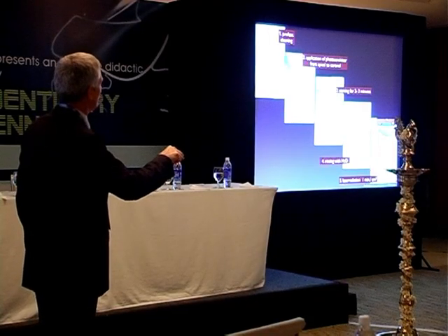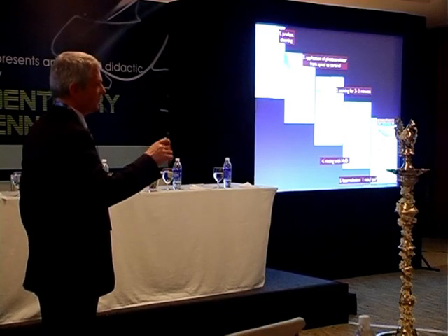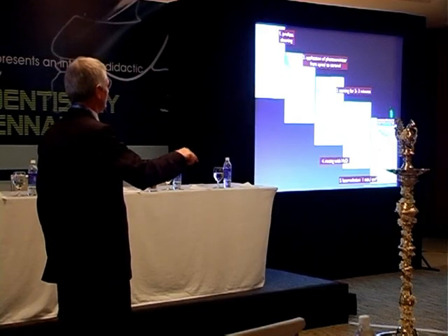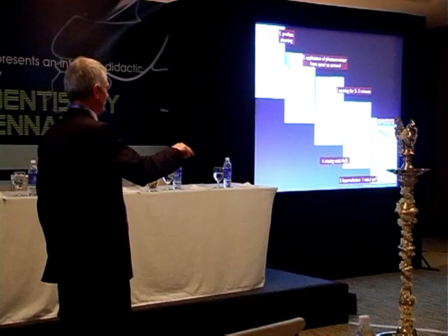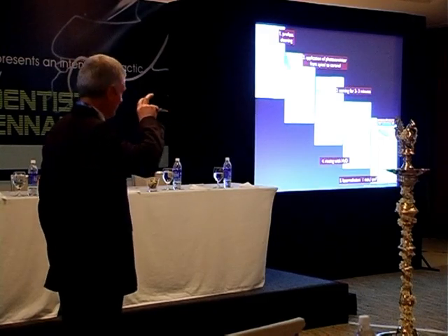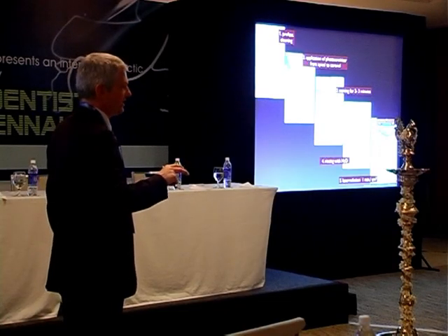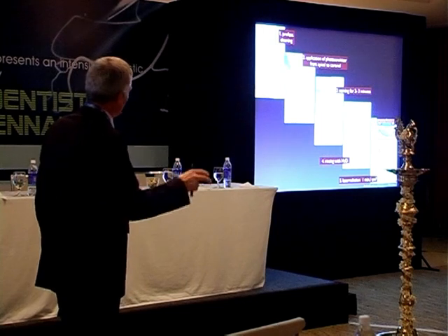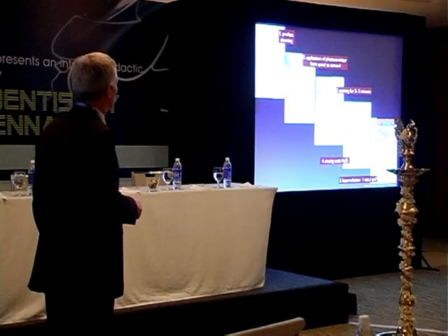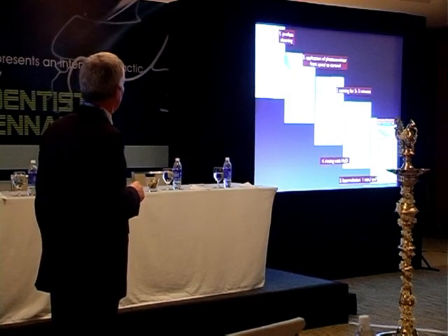You can see it here, because the photosensitizer will gather in the bacterial membrane and it will stay there even after you rinse the pocket. After you rinse the pocket, only the bacteria will be colored. So the laser light will only attack the bacteria and no part of the tissue that is surrounding the bacteria. So you can create a very, very good bactericidal effect.